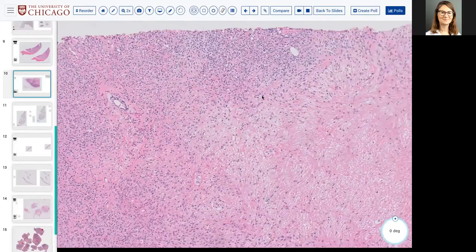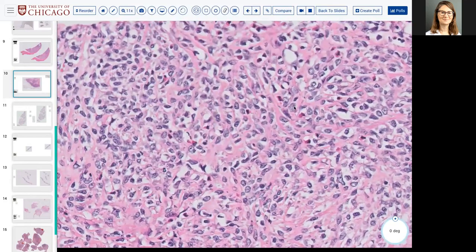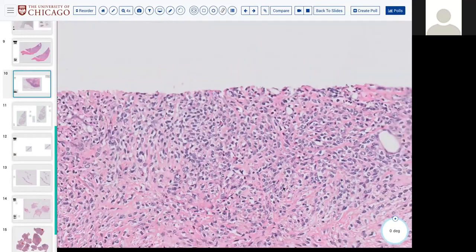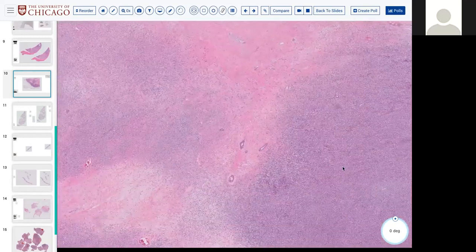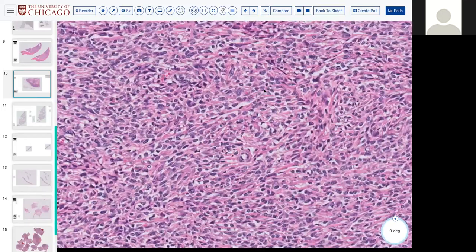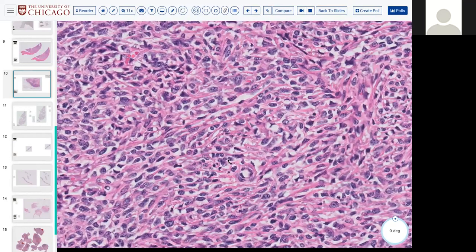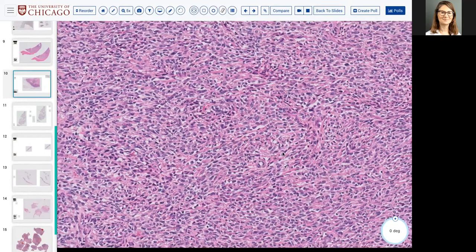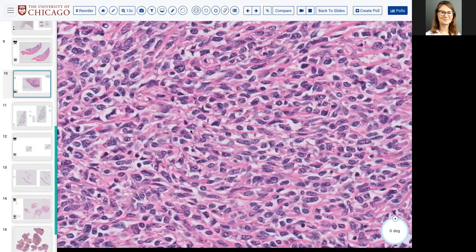Does anybody have any thoughts as to how they're going to approach this? This is not like a myofibroblastoma, or I guess I saw one with Dr. Kraus that looked kind of similar to this, at just basic morphology. Okay. Although the necrosis and nastiness doesn't necessarily fit at all. Right. So tell us how you would work up. So we have a myofibroblastoma. We have an MPNST in the comment. Okay. How would you work those things up?